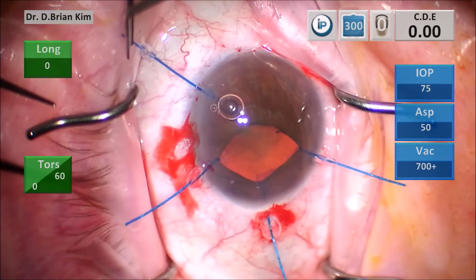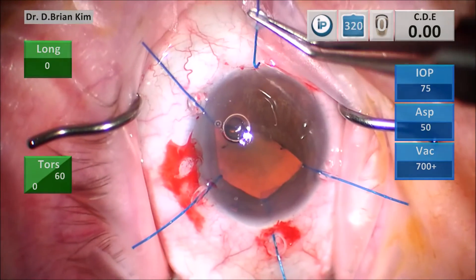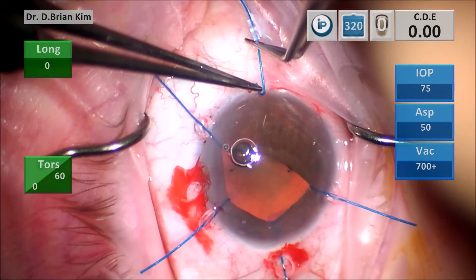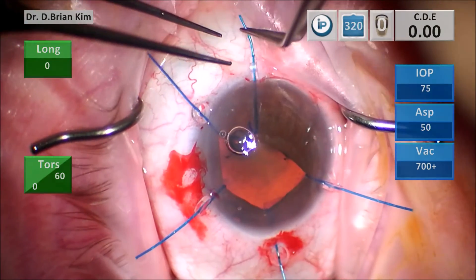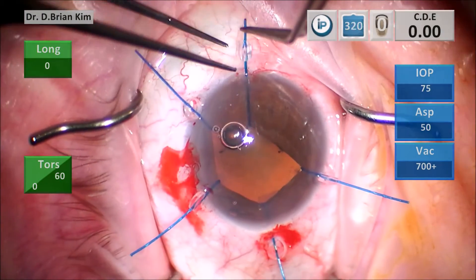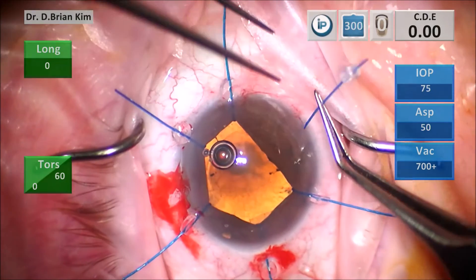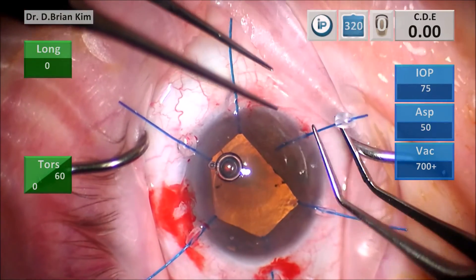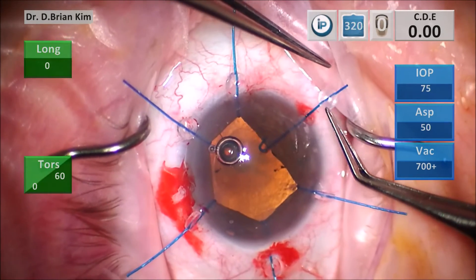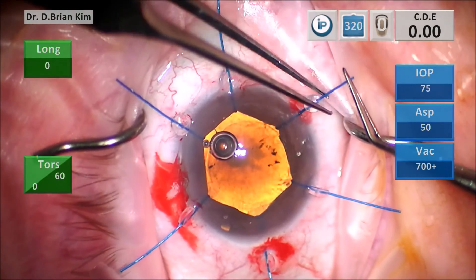What I like to do is make sure you pull the stopper all the way posteriorly, and after you do that you want to apply some torsional pressure on the stopper to dial the tip of the hook downward, and then you can retract. So again: pull the stopper back, hold close to the tip, place it into the incision, rotate the stopper so the hook is pointing down, and then retract the iris — which is fairly straightforward.